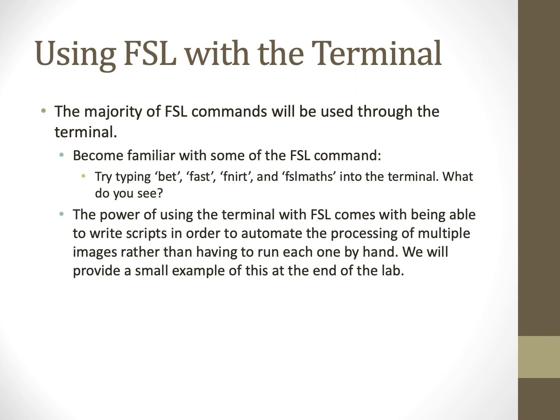And it should also give you a list of different options and functions that this command can do. The power of using the terminal with FSL comes from being able to write scripts in order to automate processing of multiple images rather than having to run each of these steps by hand. We will provide a small example of this at the end of the lab.